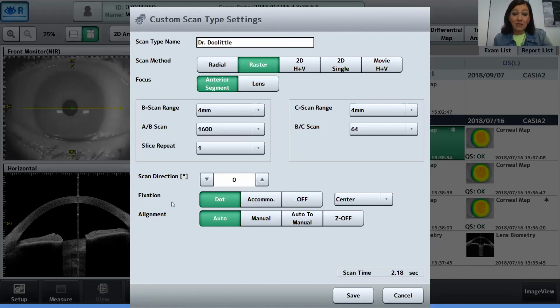The automatic alignment is actually not recommended if you do a peripheral screening, because if we assume that you want to scan the tube that you're inserting, normally a tube gets inserted up here, so you make the patient look down, and with every patient this area is somewhere else. So an automatic alignment would not really work that well.